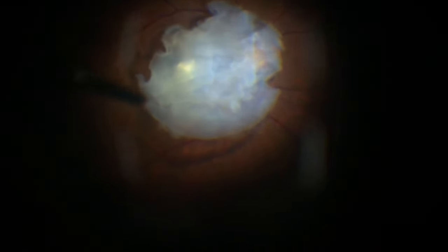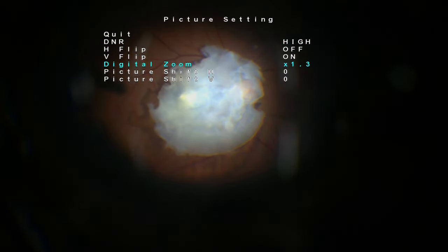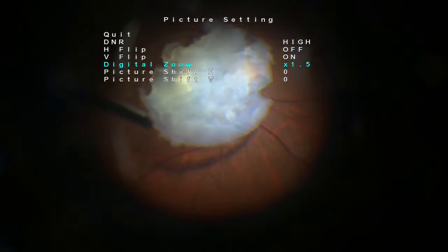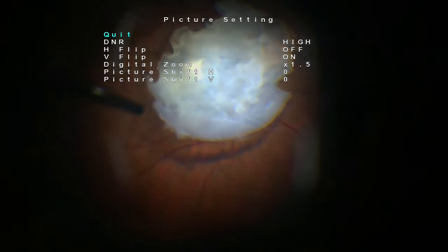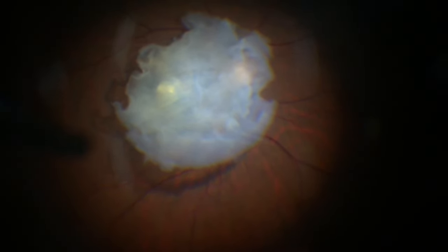The partially consumed lens will be further removed using the vitrectomy cutter's aspiration and cutting. Aspiration and cut can be alternated because the machine we are using has a dual linear foot switch, so we can turn off the cutting at will.